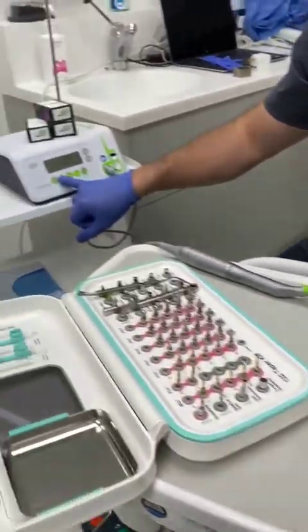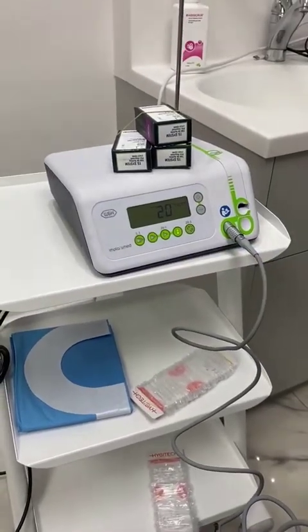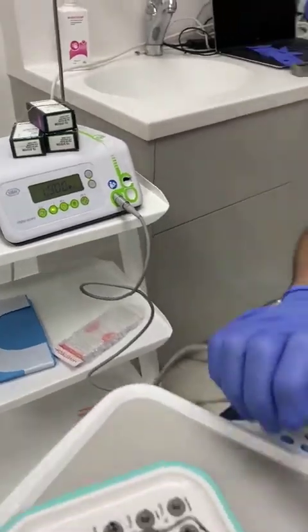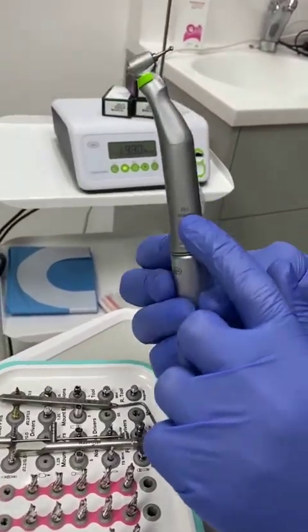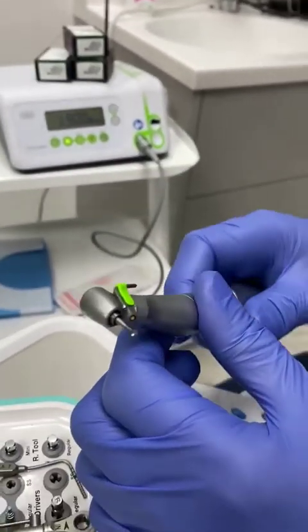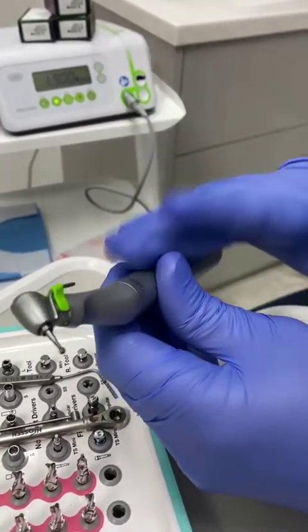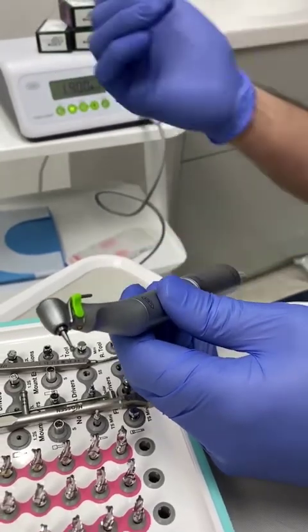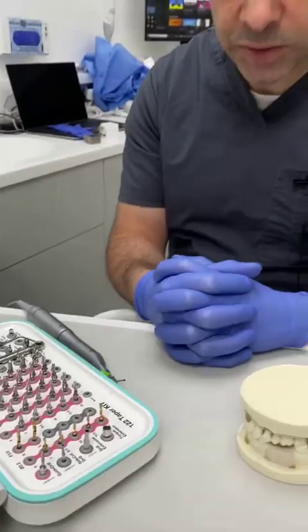We're currently using a W&H Implant Med motor, but there are many others. I'll show you the settings we use for that. The implant handpieces are usually 20 to 1 reducing handpieces. The settings differ depending on what handpiece you're using — for NSK with an NSK machine, or NSK with a W&H machine and so on — but this you can work out when you speak to your manufacturers.